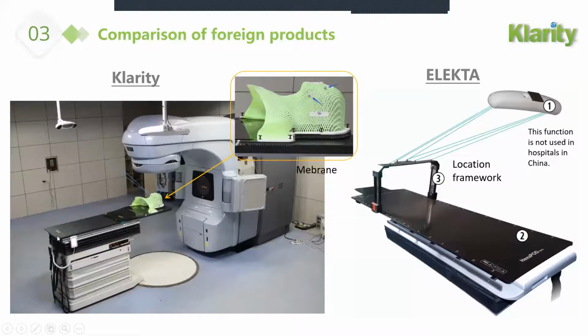And this is the comparison with the similar products. We compare our product with Elekta. The difference is our product has 2 cameras and Elekta has 1 camera. And about the mark, we paste the mark on the patient's mask, but the Elekta mark is on a frame.